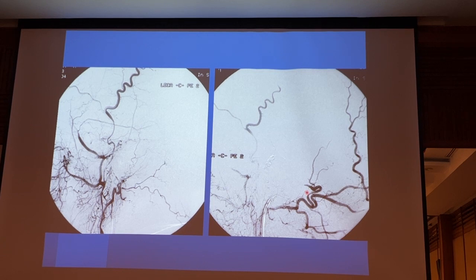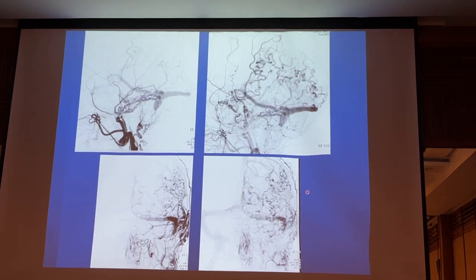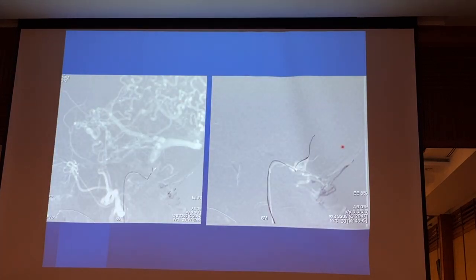And this is after the treatment. Okay, in some cases, you may be forced to go to the transvenous approaches. How about this case, the initial case I showed you? This is an isolated shunt. I tried to go to the occluded segment, but the guide wire went in and I couldn't pass the catheter. Okay? I forced, and I couldn't, and I gave up. And we decided to go intraoperative.